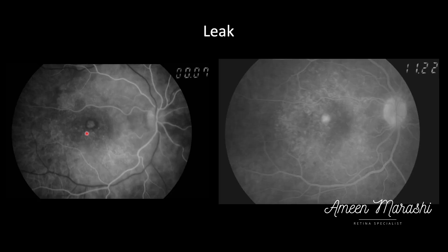In contrast, a leak will show early hyperfluorescence with distinct borders; however, in late phases those borders become fuzzy, and it will increase in size and increase in intensity of the hyperfluorescence.